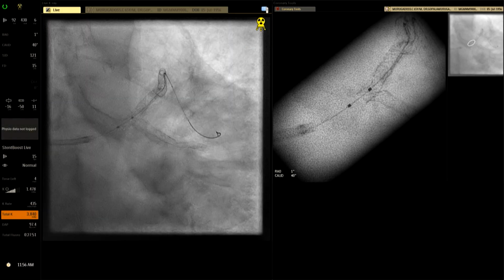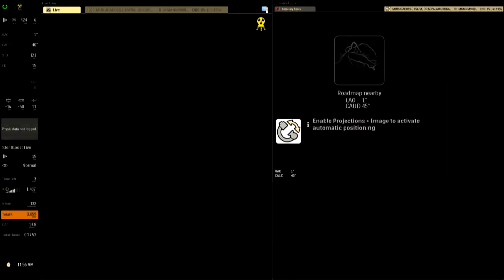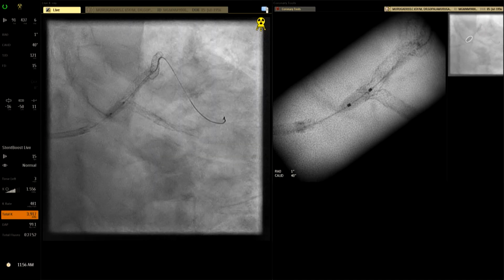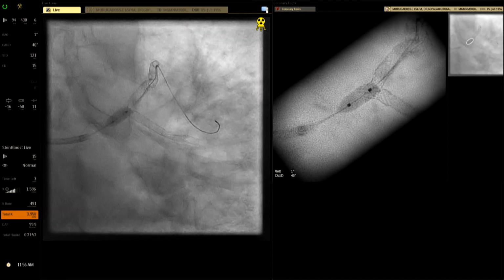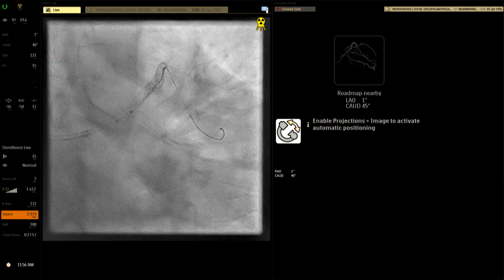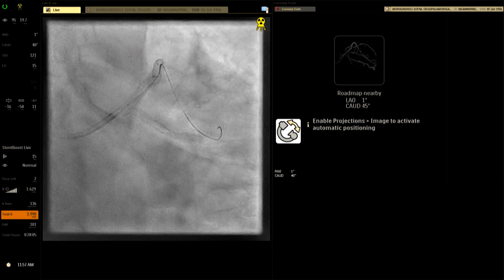You were not sure, Dr. YVC? What do you think? I think a little bit drag back towards the guide. Yes, this is good. Better? Okay. Go up. 6, 8, 10, 12, 14, 16, 18, 20, 26. Okay, down. I think that position looked good, at least angiographically. This is where, if there was a chance, I would be very happy covering the left main, at least on the inferior rim. True, so true.